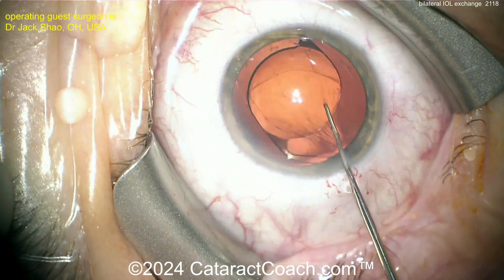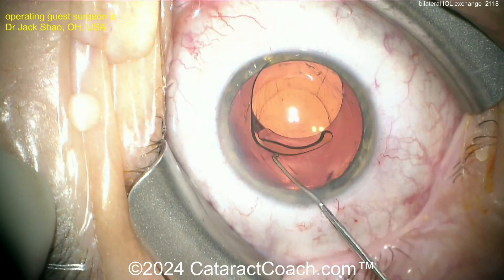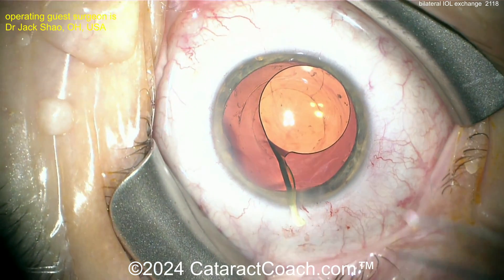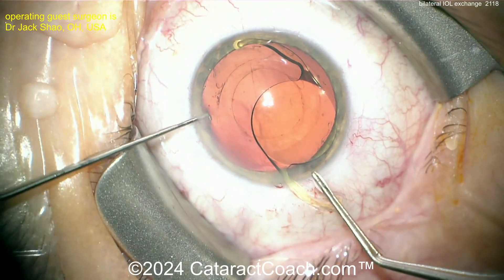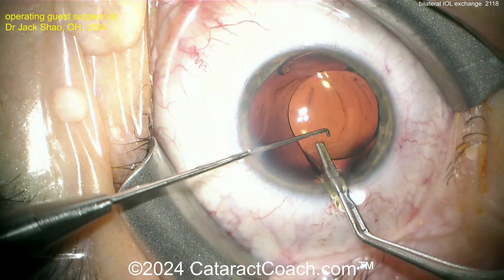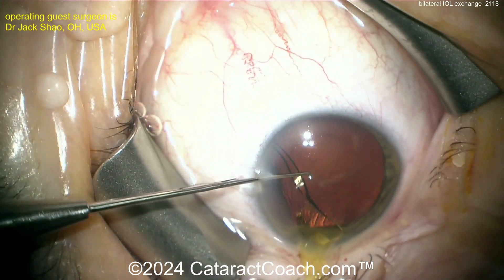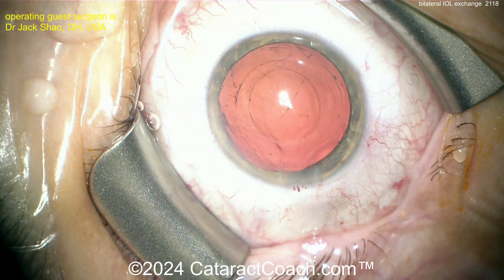An extra pair of instruments can help here. Try to get it dialed up and out — there it is. Now the rest should be relatively easy with the lens freed up. Get it into the anterior chamber. Look at that slick technique to bring one haptic out — I bet we're going to do my favorite twist-out. Grabbing with the forceps, and now there's the second instrument going across it.